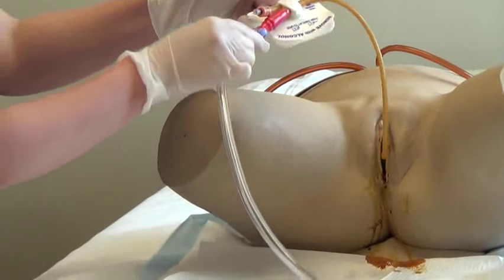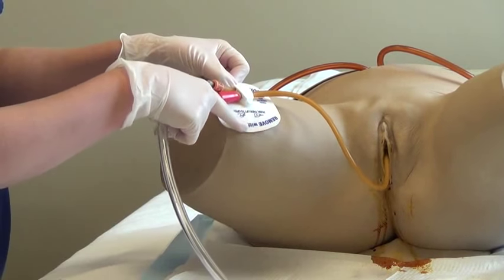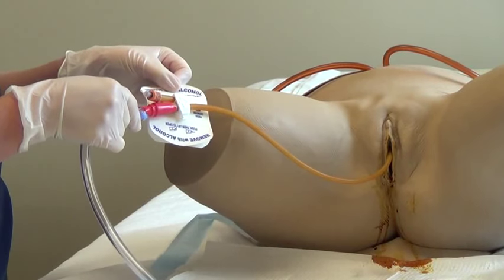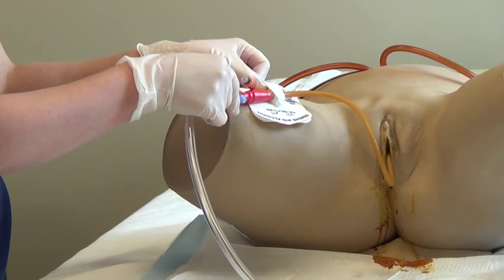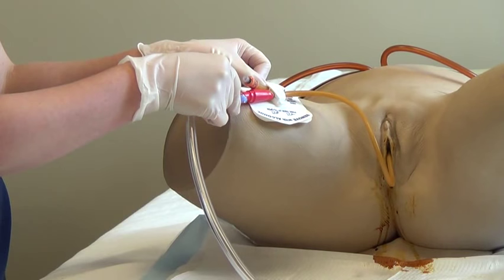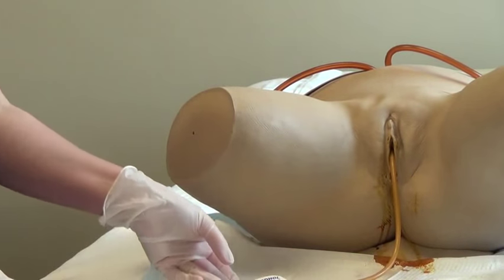Identify the proper securement site by gently laying the Statlock device on the front of the thigh, then back up 1 inch towards the insertion site. Make sure the leg is fully extended. Gently place the device off to the side while you prepare the skin.